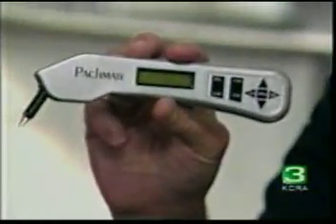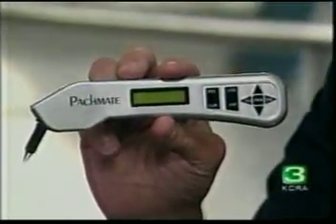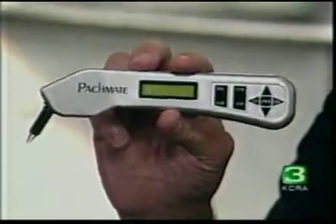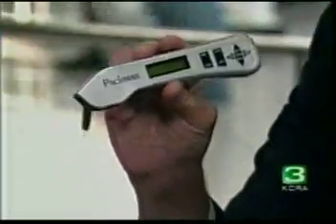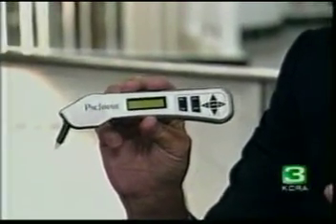Now, what is this thing? This is called a pachymeter. This is an instrument that we use to measure the thickness of a person's cornea. Okay, and that's useful because? Well, in laser surgery, it's really critical that we make sure that the corneal thickness is adequate to safely do the surgery. And this instrument will bounce a sound wave off a person's cornea 25 times in 2 seconds, give us a corneal thickness and a standard deviation of those measurements all at the same time.